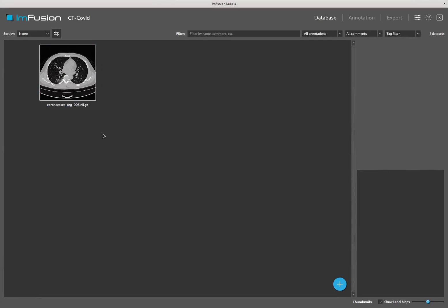Hi, and welcome to this demonstration of ImFusion Labels, our annotation software. This video aims to show some of our tools available for producing a successful segmentation of the lungs in a COVID context.